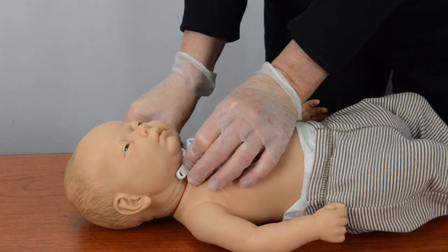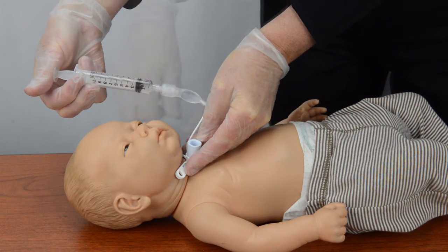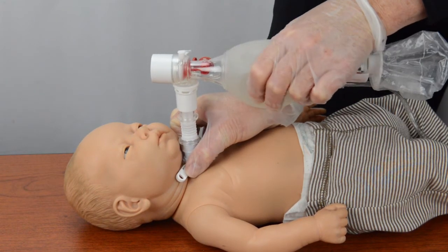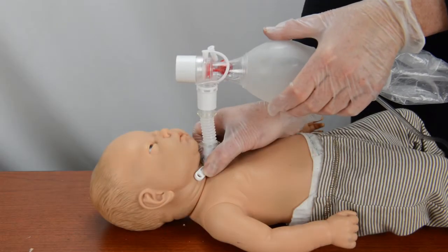While holding the new trach tube in place, inflate the cuff if the patient has a cuffed tube. Then attach the resuscitation bag to the trach tube and squeeze the bag firmly and repeatedly. Look at the patient's chest to see if it rises each time you squeeze the bag.